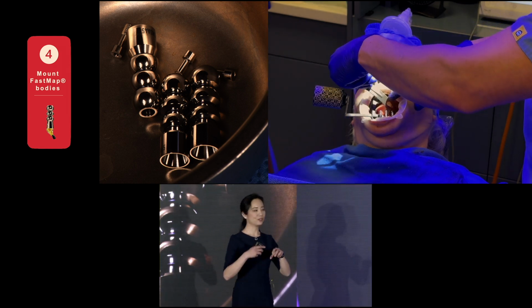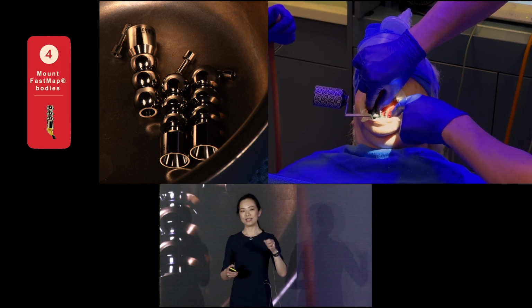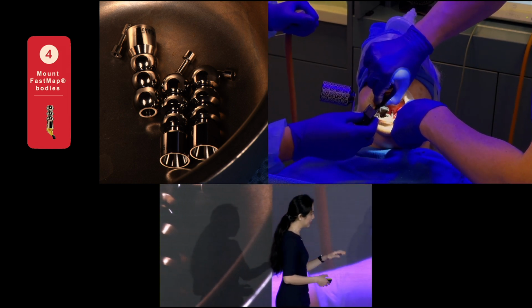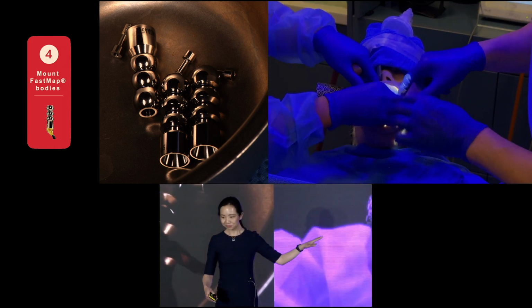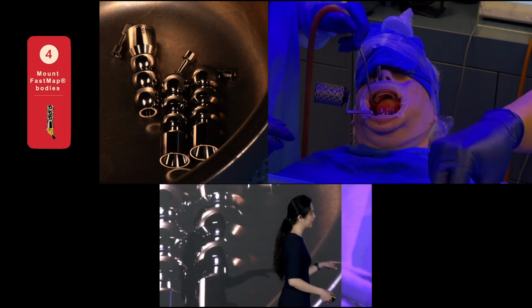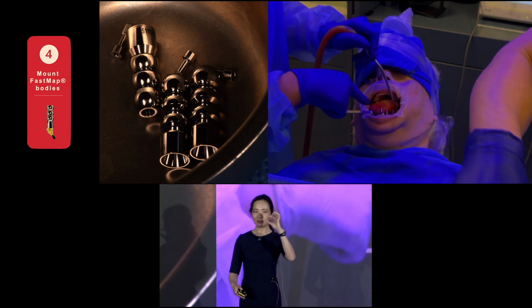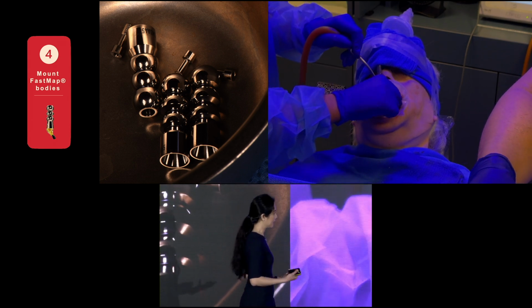Because if you had sutured first and then seated the scan bodies, you're completely relying on either taking PAs or tactile sensation to ensure that the scan body is completely seated. So I actually prefer to do all my photogrammetry scans before suturing. So replacing scan bodies, this is occurring in real time. It's really quick. What you'll see is that these are about 1.5 inches tall, maybe 1 inch tall, but it doesn't get in the way of access.